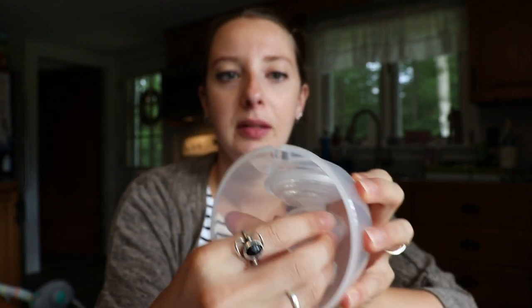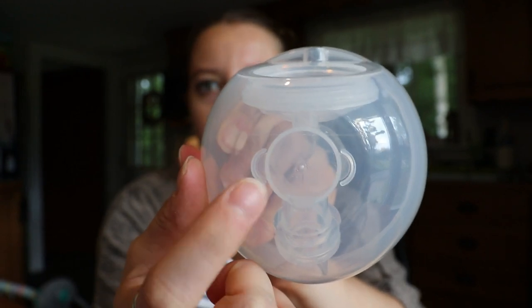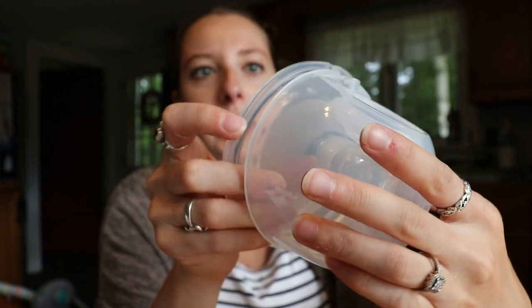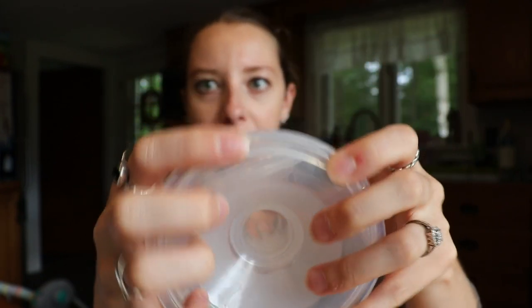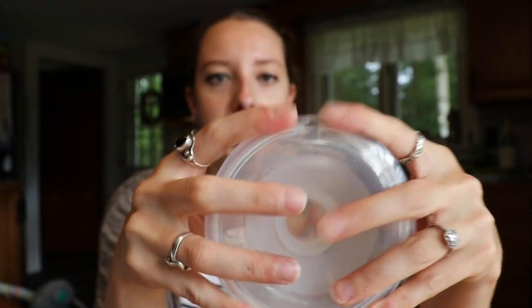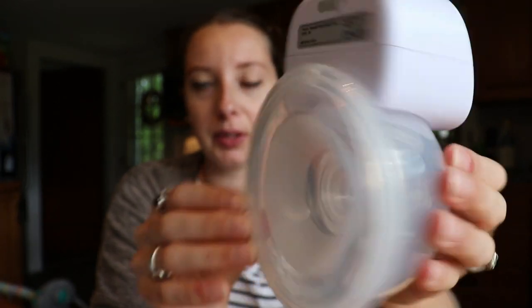To put it together, you would just pop this in here. Hopefully you guys can see there are two little things in the back to line up that little contraption in there. You really want to push it up and make sure it's nice and snug. Then this part would just go right in here. You want to make sure that the holes at the top are lined up because that's where you pour milk out of. Make sure it has a nice tight seal around the edge, then put the pump back on top — make sure there aren't any gaps and it has really nice suction.